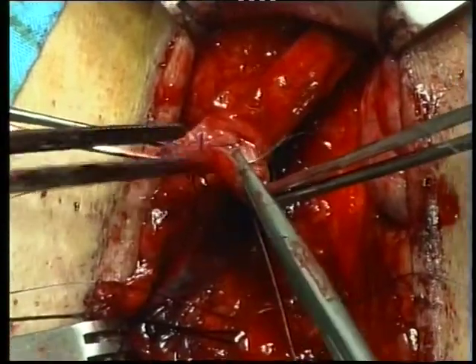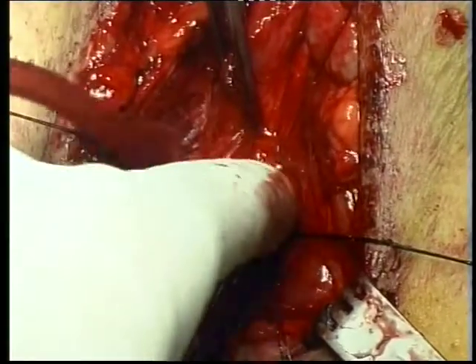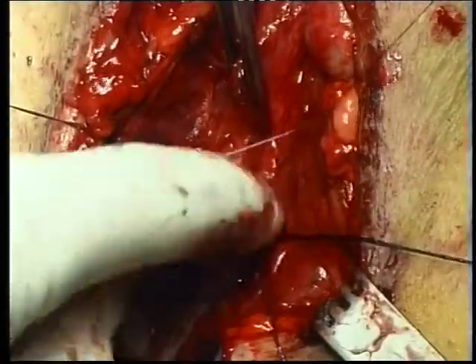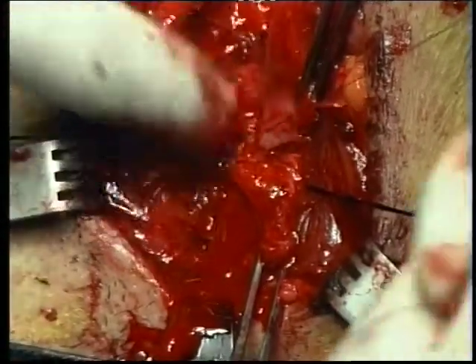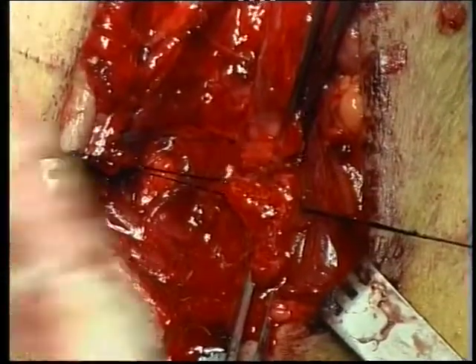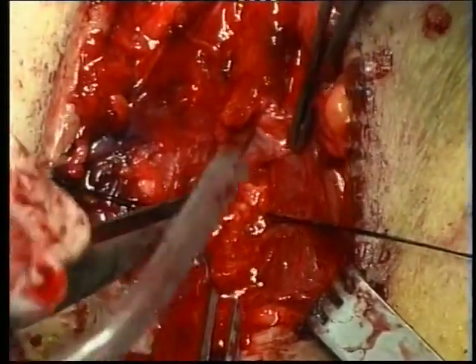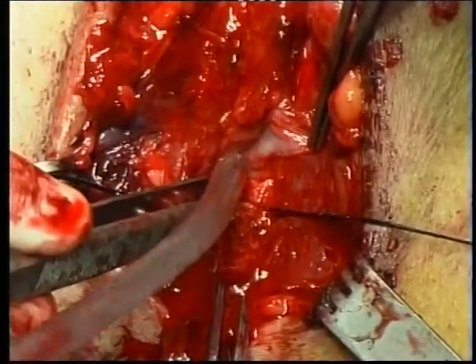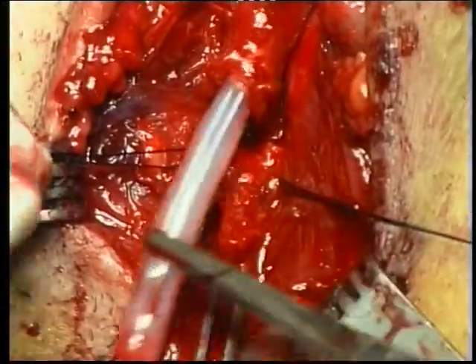When the urethral ends are mobilized so that an overlapping spatulated anastomosis can be performed without tension, the anastomosis is begun in the midline on the dorsal aspect with sutures incorporating mucosa and spongiosum. After the dorsal wall of the circumference is complete, an 18 French Foley catheter is passed and guided into the bladder.